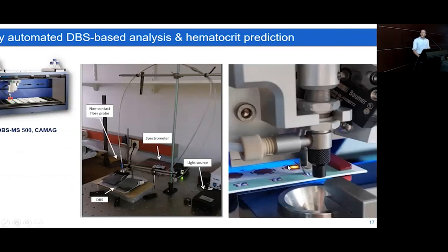There's a bundle of light shining over here at a specific wavelength. You look at the reflectance at 589 nanometers. That allows you to cope with all different ages of the hemoglobin, because again, you don't want to get a different result for fresh versus old spots. The reflectance is just taken up again, and you get the result without actually consuming parts of the dry blood spots.